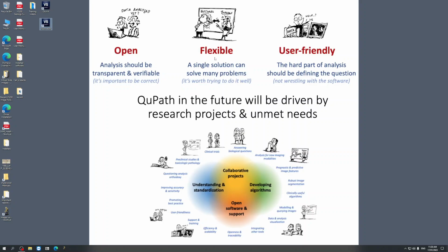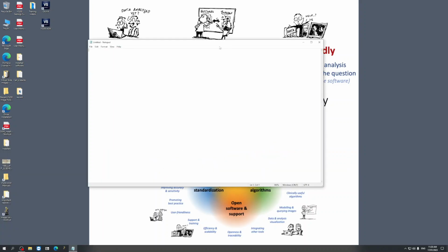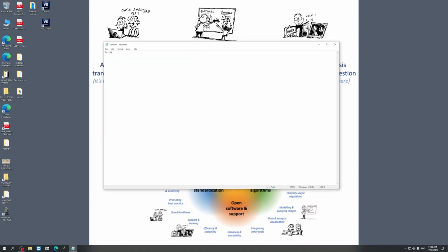First of all, the most practical way to set up a sample is to open a notepad such as this and write down the batch that you want to scan. The stage we're using at the moment has a number of pockets, and you can set up 2 or 3 batches during your experimental session. What I normally do is I separate the batches in 3 of them, for example. That will make what normally is a sample collection.